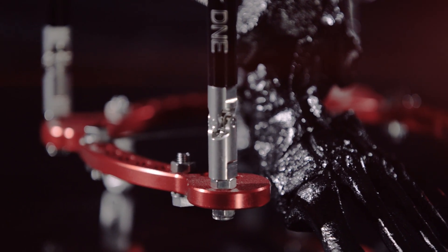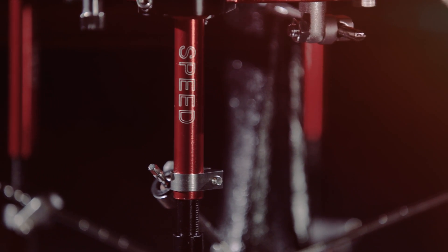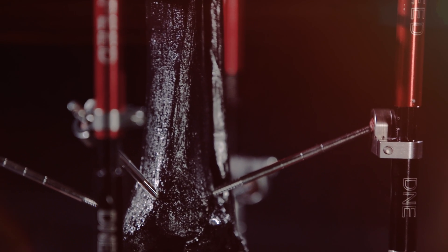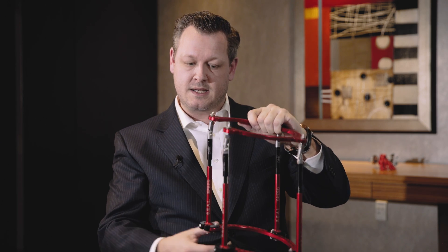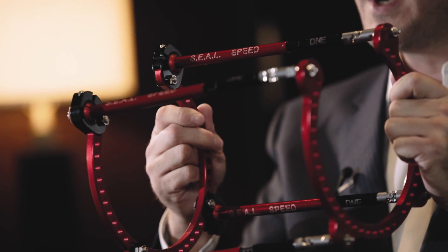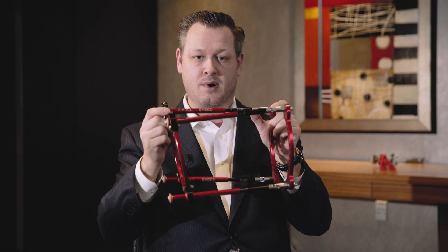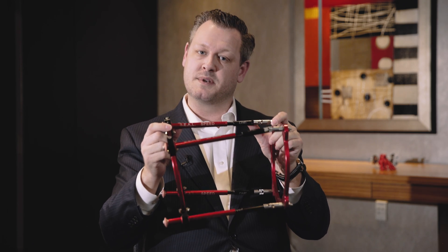Not only do you have the hinge struts that allow for well over 45 degrees of motion, but you also have angulated fixation points on the ring components of the frame. These are connected to either half rings, 5/8 rings, full rings, or full foot plates.